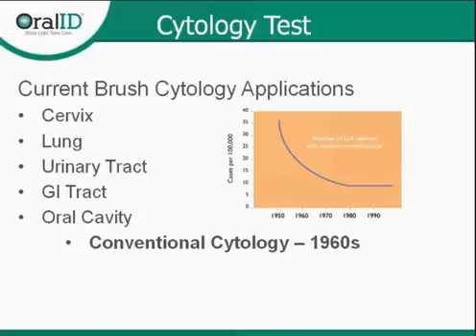And so for those women who've ever had a pap smear, you know it's not painful as far as the scraping aspect because it's not scraping. We call this a cytology swab. It's a bristle brush, but you're just collecting the cells on the surface. We actually don't want any bleeding in the sample whatsoever, so it's very, very comfortable for the patient. Because it's not a biopsy, the hygienist can also perform this test.